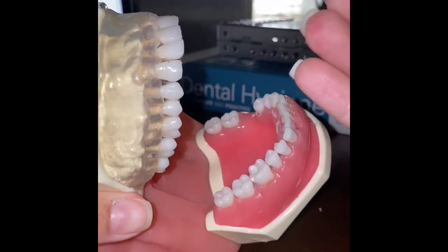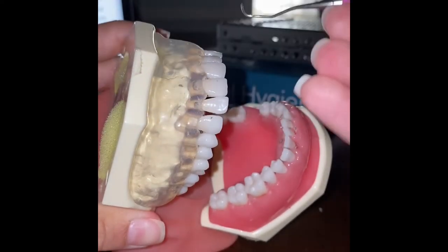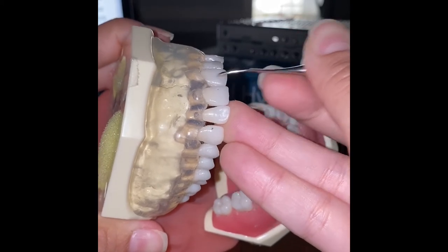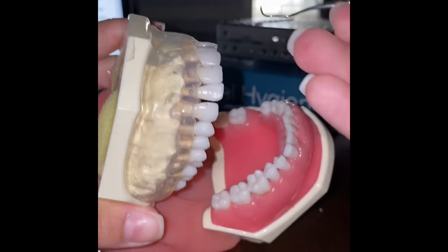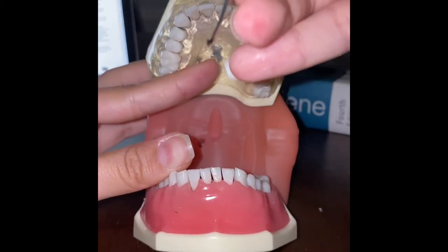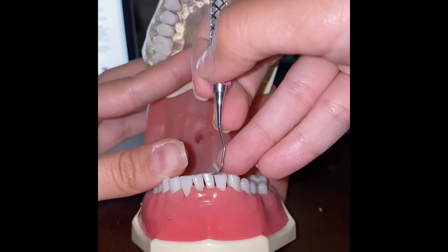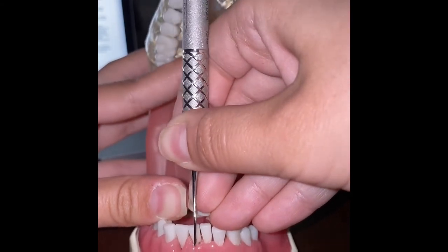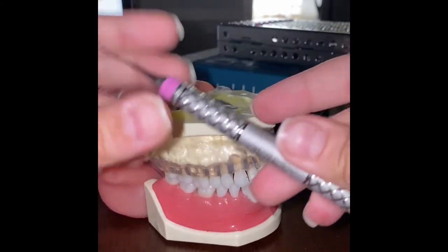I'll show away surfaces on teeth 8 and 9. First we find the working end, which is the lower blade. We begin at midline and work interproximally. I will also show toward surfaces on teeth 24 and 25 — again finding our lower blade, beginning midline, and working fully interproximal. That concludes our Gracie 1-2 demonstration.